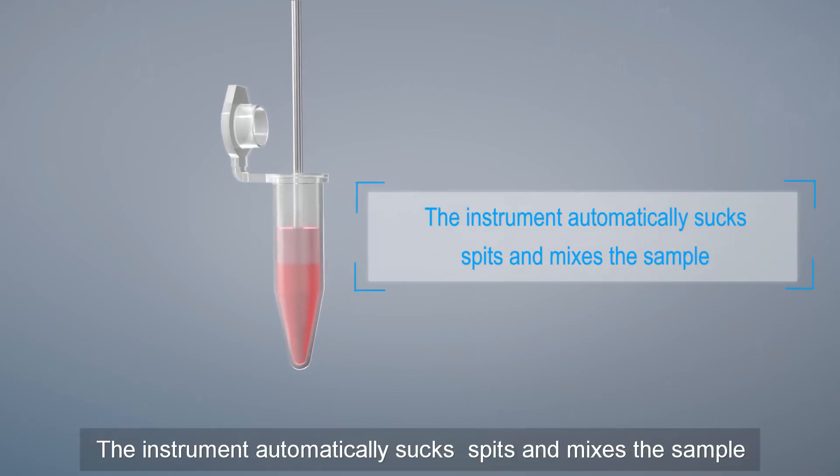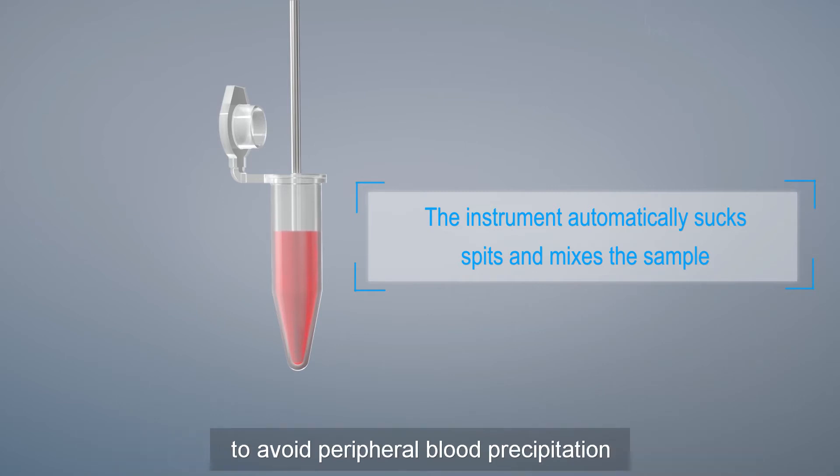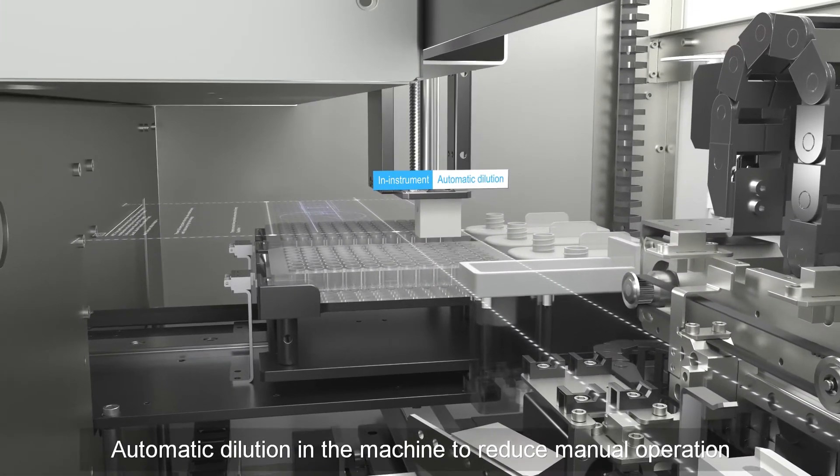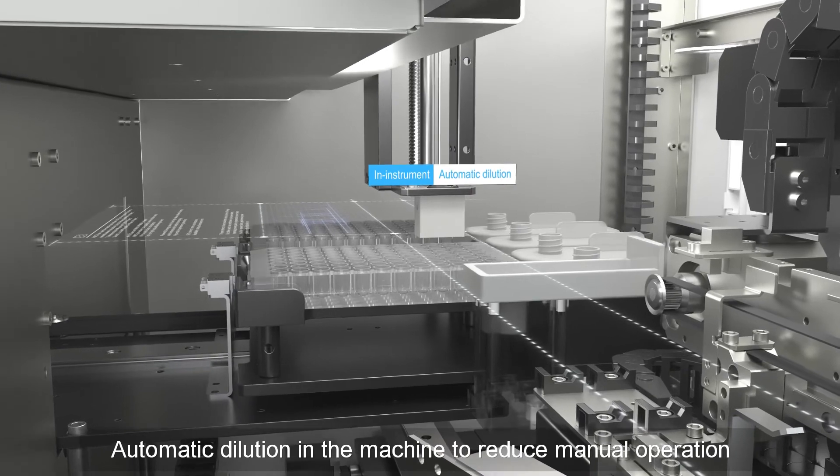The instrument automatically sucks, spits and mixes the sample to avoid peripheral blood precipitation. Automatic dilution in the machine reduces manual operation.